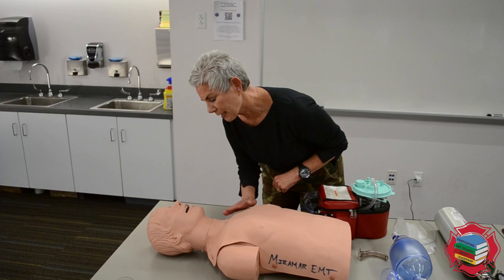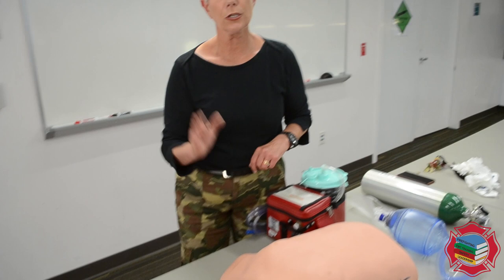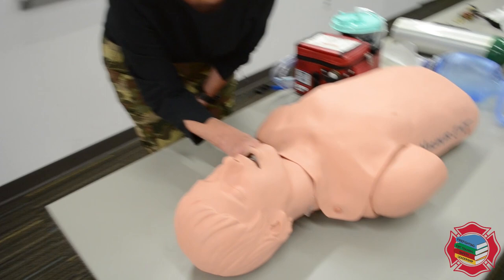We're going to go up to our victim and tap and shout: sir, sir, open your eyes, wake up. He's not responding. I'll go ahead and do a trap squeeze — no response, unresponsive patient. Could you call ALS and get me an AED.